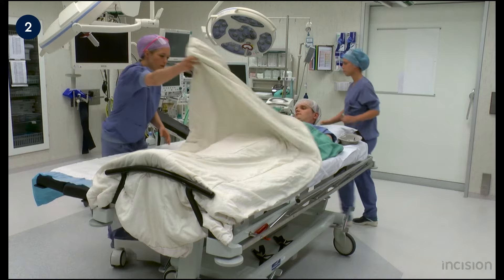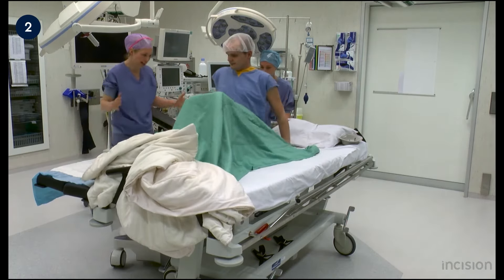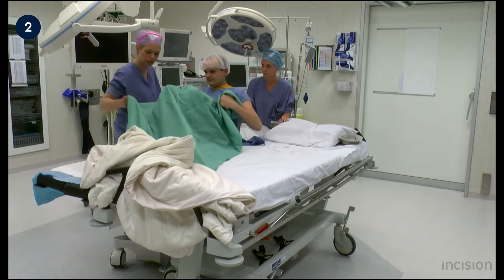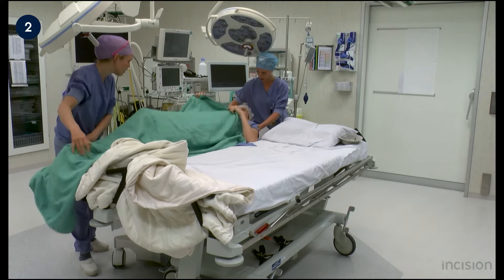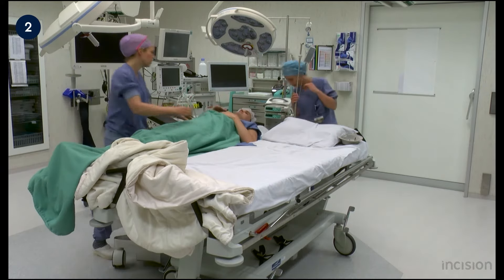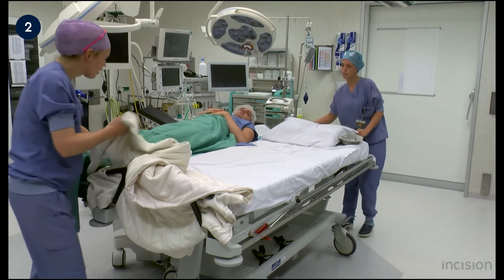The sheet is removed and the patient is asked to transfer to the operation table himself. He should be in the middle of the table; to ensure this, the edges of the bed can be felt. The brakes on the patient's bed are then removed and the bed is removed from the operation room.